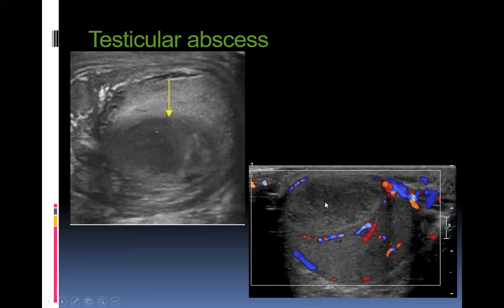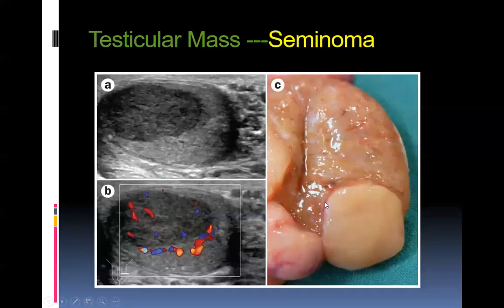It's not a tumor. So what is the more likely tumors? What is the commonest tumors in the testes? Seminomas, okay? The seminomas are the more common ones. And then there's another one, non-seminomatous. These are all germ cell tumors, okay? So now you see that there is blood supply inside this lesion, which is inside the testes. If you see blood supply inside, again, the color filling is helping you out to differentiate abscess from the tumor itself.